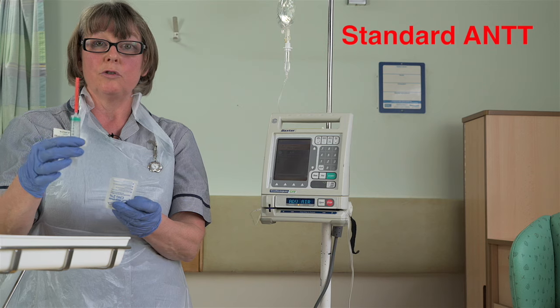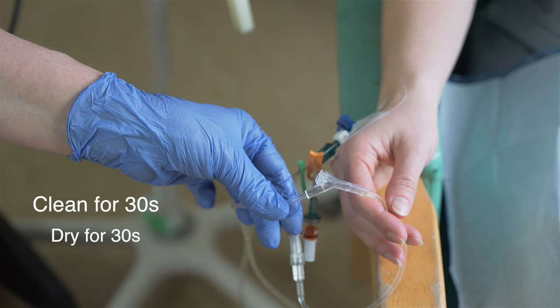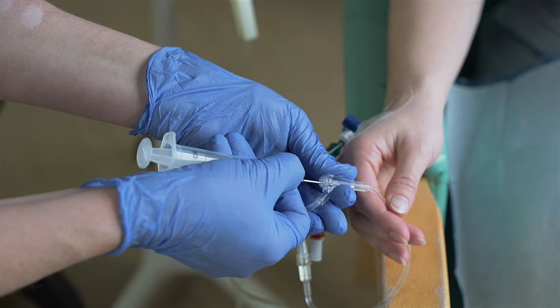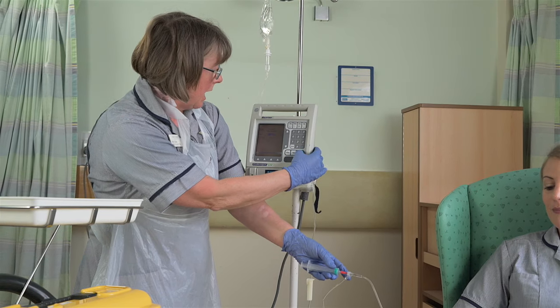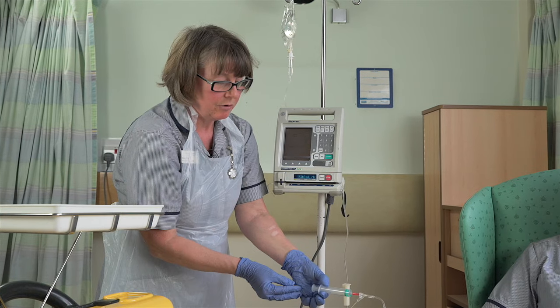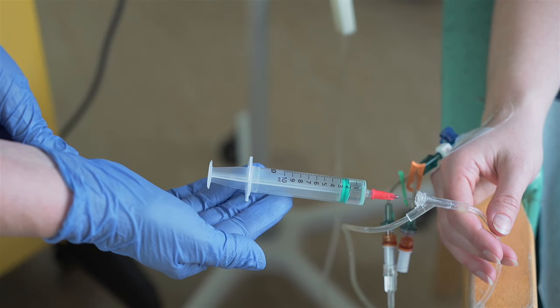You need to take your syringe and your wipe and clean the port. You then insert the needle into the port, clear done, and press start. You will see that the fluid will now come into the syringe and will remove any air that is in the tubing.